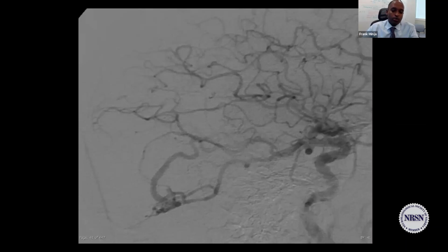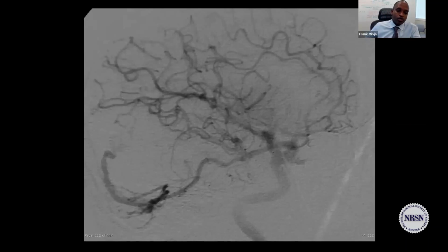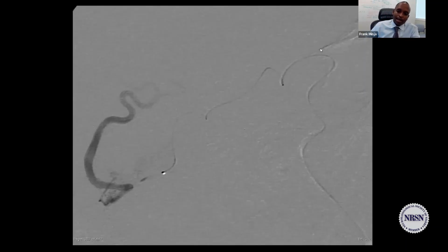So they go on with a proper diagnosis. They go on and super selective. Again, we're trying to select that little AVM. They go in with a catheter, threaded. These are our interventional neuroradiology colleagues that feed and go into that feeding artery, and now they selected the nidus nicely.